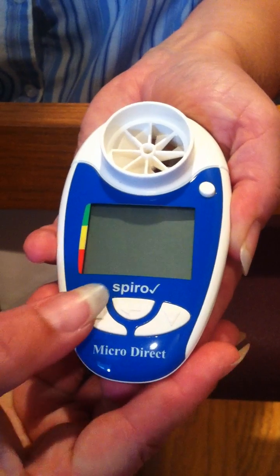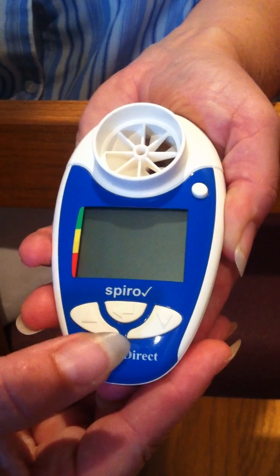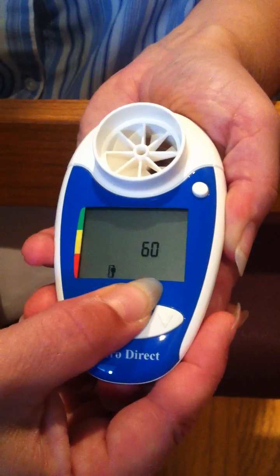Next, the person's height is entered by pressing the up or down arrow key, and when the correct height is displayed, press the enter key.